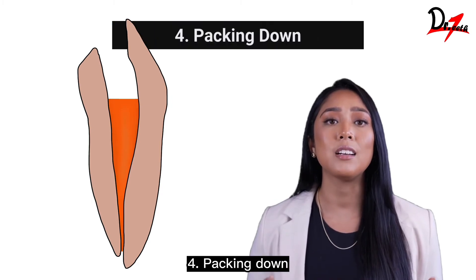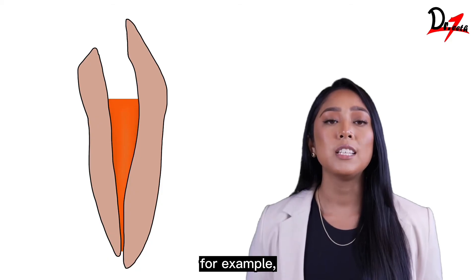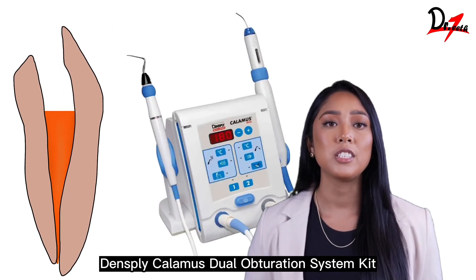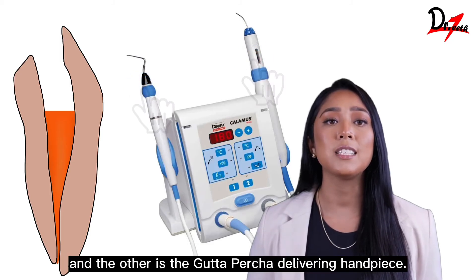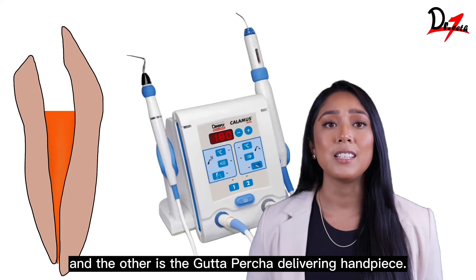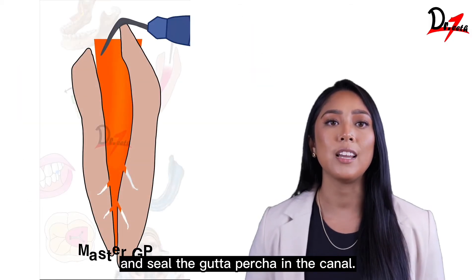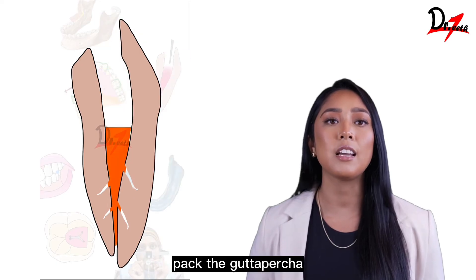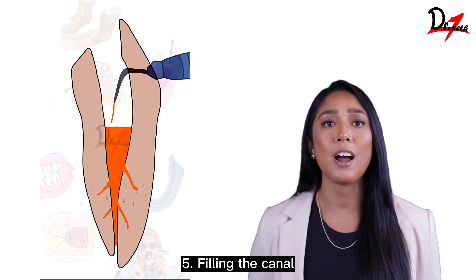Stage 4: Packing down. Many obturation systems are available in the market. For example, the Dentsply Calamus Dual Obturation System Kit, which has two handpieces — one is the heat carrier and the other is the gutta percha delivering handpiece. Heat the carrier and use it to warm and seal the gutta percha in the canal. Pack the gutta percha in the middle and bottom parts of the canal using the pluggers.